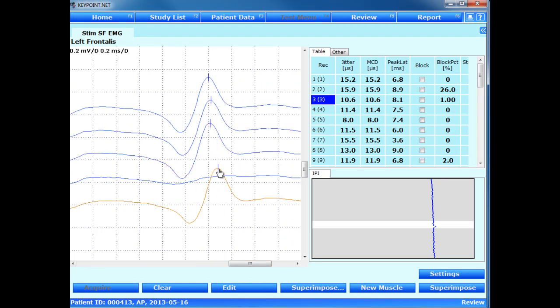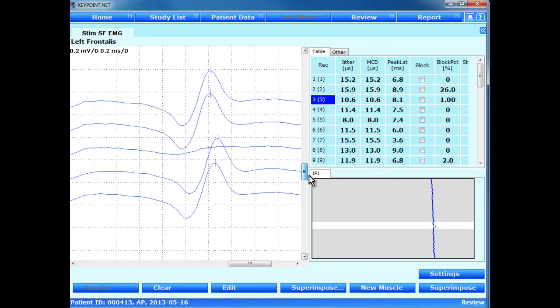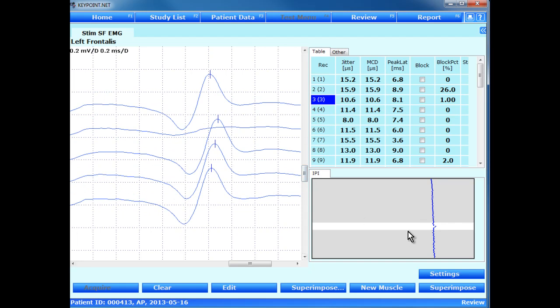all of a sudden a longer jump, and that is the situation where the fibers have lost the VRF effect and it goes back to original, and the next one will now be shorter again. So this is a VRF effect of blocking.